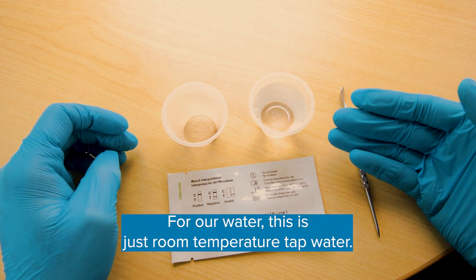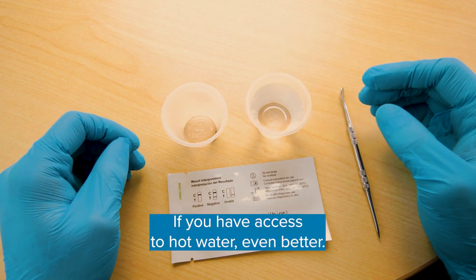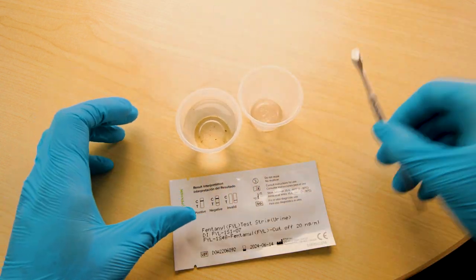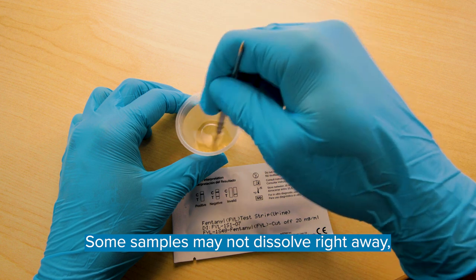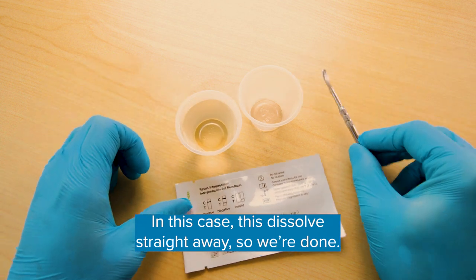For our water, this is just room-temperature tap water — about a shot glass worth, 30 milliliters or an ounce. If you have access to hot water, even better. Pour in your water, making sure not to splash it or spill it. Give your mixture a good mix. Some samples may not dissolve right away, so make sure to stir it until at least most of it has. In this case, this dissolves right away, so we're done.